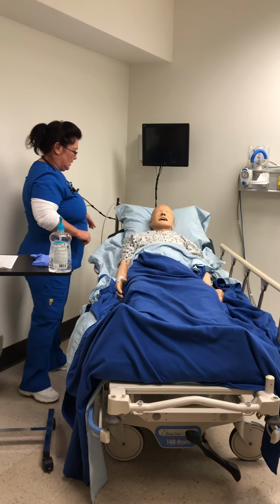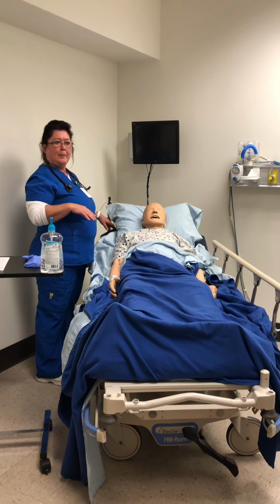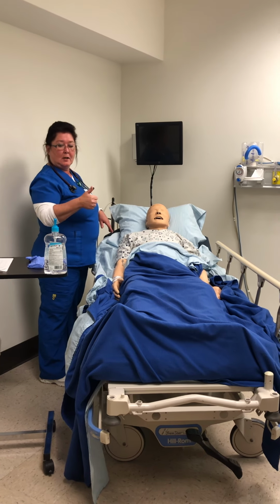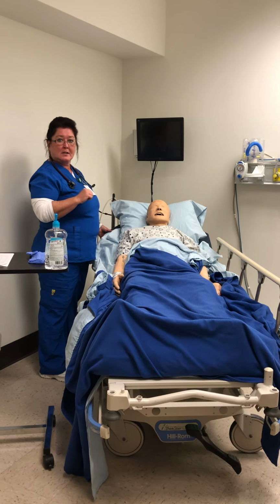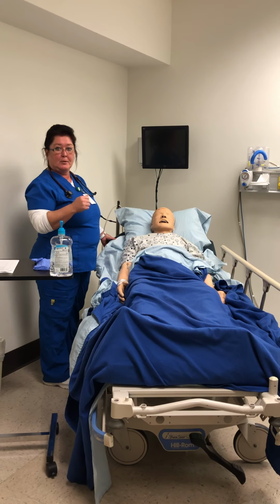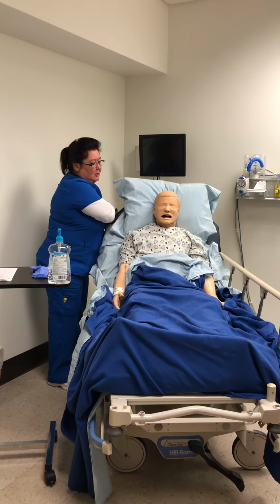Okay, so I've also explained to Shirley that when we do the insertion of the tube, we have come to an understanding on hand signals. So if everything's good, she's going to give me a thumbs up, and if it hurts or she can't breathe, she's going to hold her hand up so that I know to stop, and I promised her I would stop. So I'm going to sit her up in the high Fowlers.